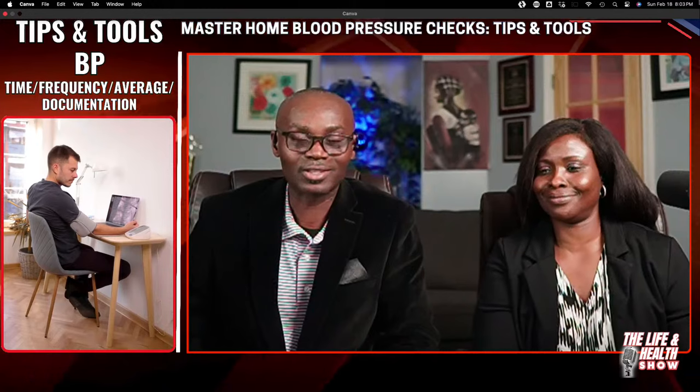And another tip is actually also to take it morning and evening. So you do the morning readings and you do evening readings. And that will give you a sense of what it is. Some people's pressure goes higher in the mornings when they wake up. It's very high. But as time goes on, it calms down, and then in the evening, it is very low. Or for some people, it's the opposite. They wake up with low pressure, and they start increasing in the day, maybe because they are stressed at work, stressed by kids, stressed by wife, stressed by husband, and then by the end of the day, their pressure is high. So however yours increases, you can only find out if you check it both morning and evening.